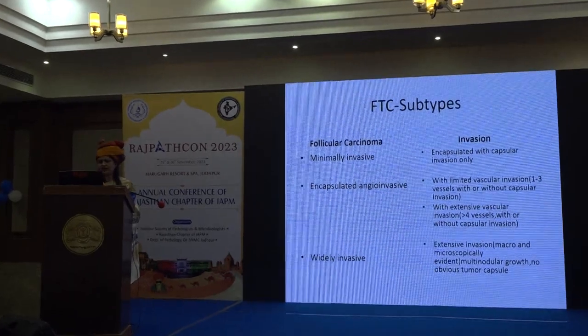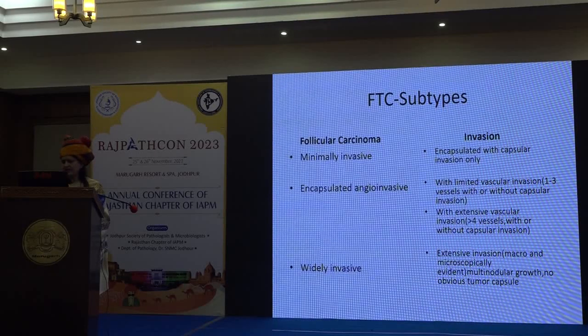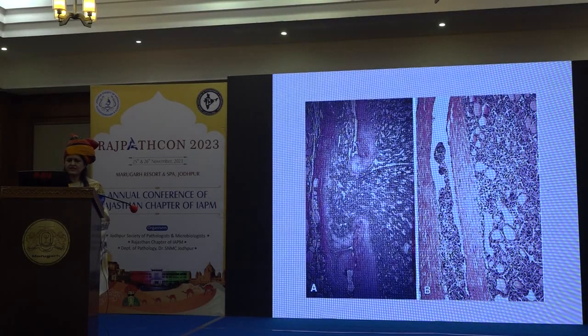Again, the follicular thyroid carcinoma, we know the minimally invasive, angioinvasive and widely invasive. The criteria are very well known, everybody knows that. And here you can see the mushroom-like capsular invasion of these tumors, where you can see the capsular vascular invasion.